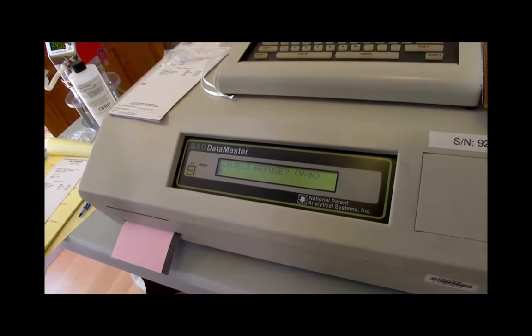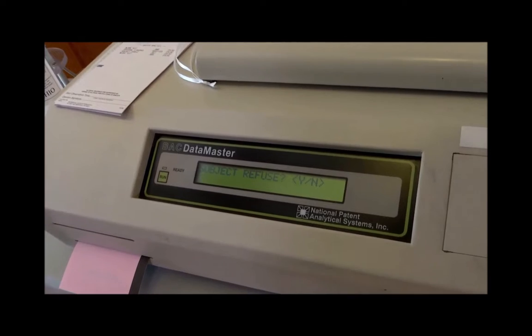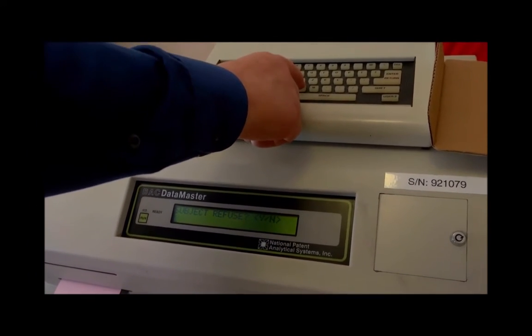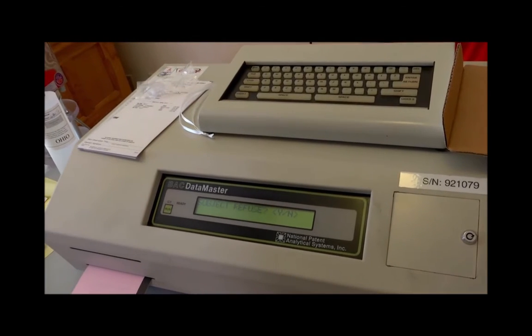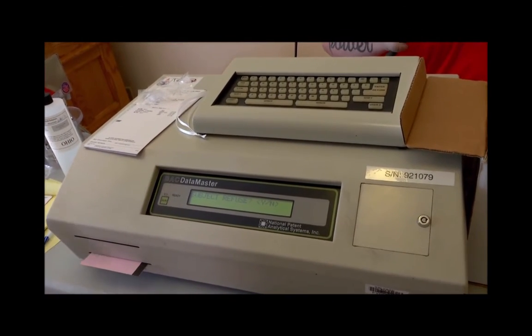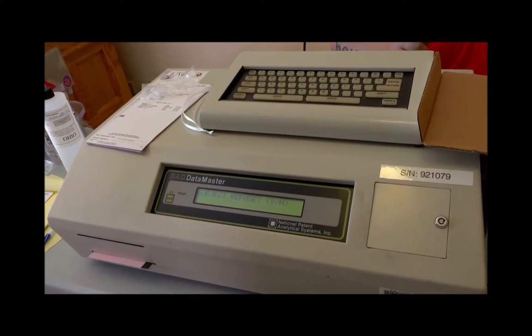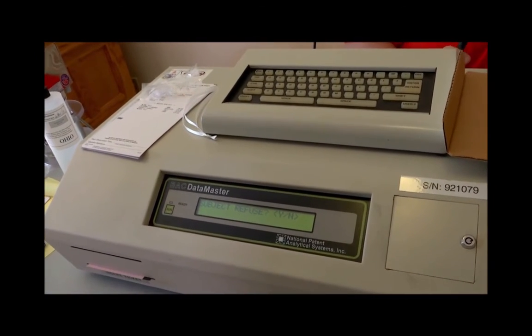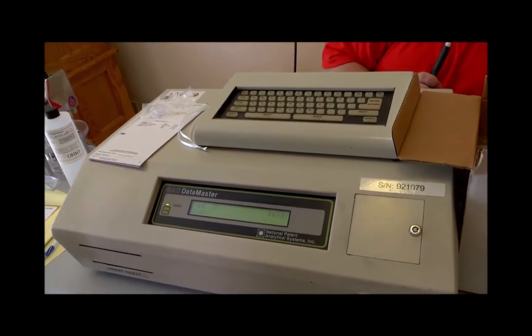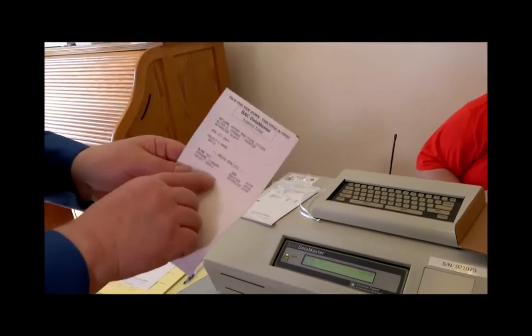The machine is asking if does the subject refuse, yes or no. He's not refusing. We're going to have you try it again. Had I pressed yes, then the printout would have been a refusal. We'll see what the printout is with a not refusal. And it's an incomplete.